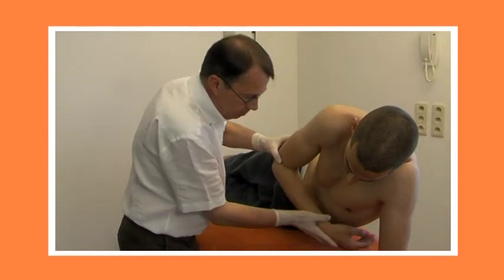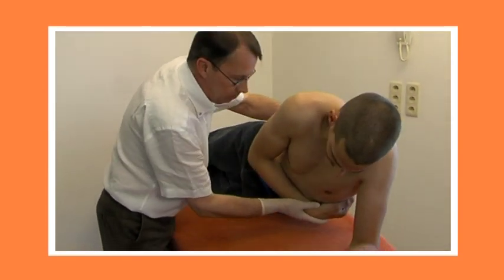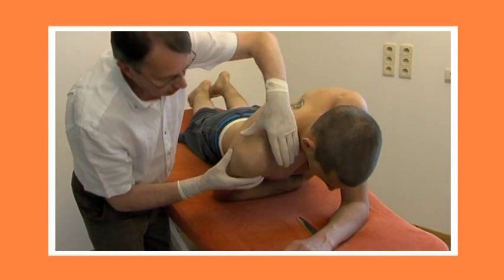The patient lies prone on the couch, his arm by his side, his elbow flexed 90 degrees and his forearm under his abdomen.